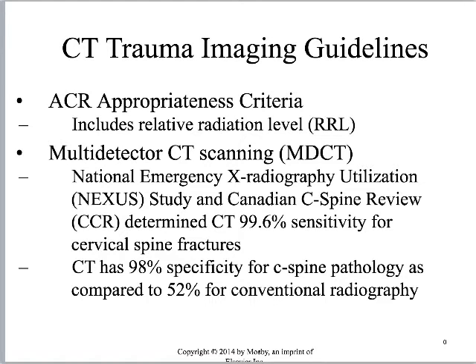So that's just kind of a lawsuit waiting to happen when you see that range in specificity. And there are things that X-ray still shows better. X-ray is going to have a lot more spatial resolution. So if there's a very fine fracture, sometimes it's more detectable on X-ray.